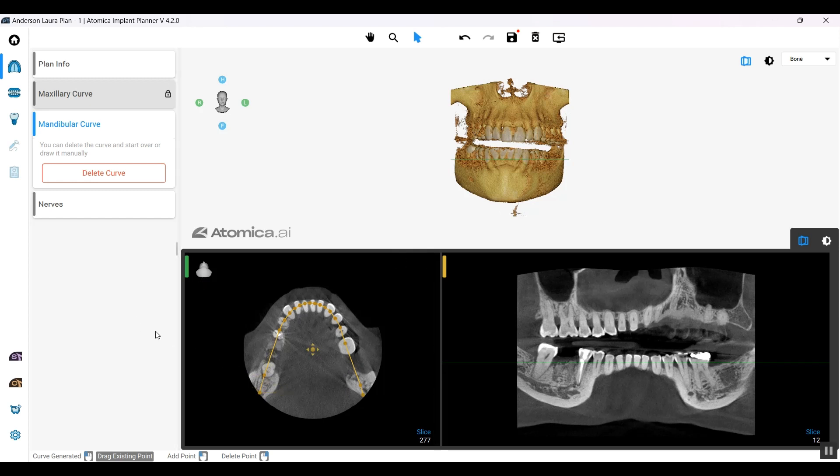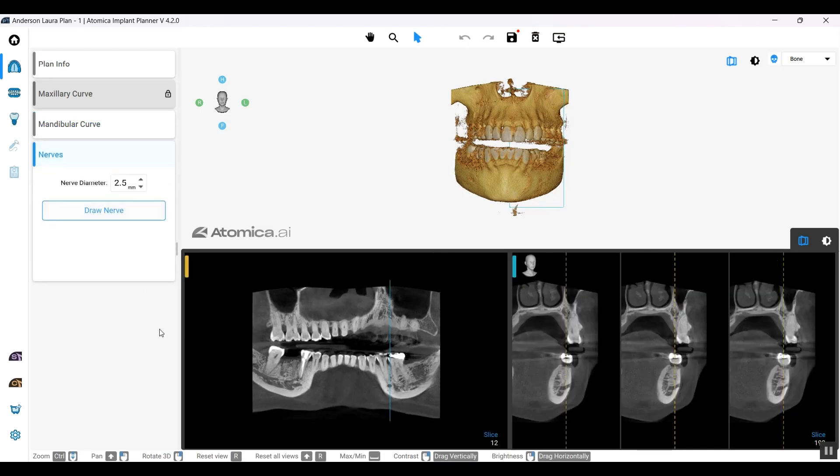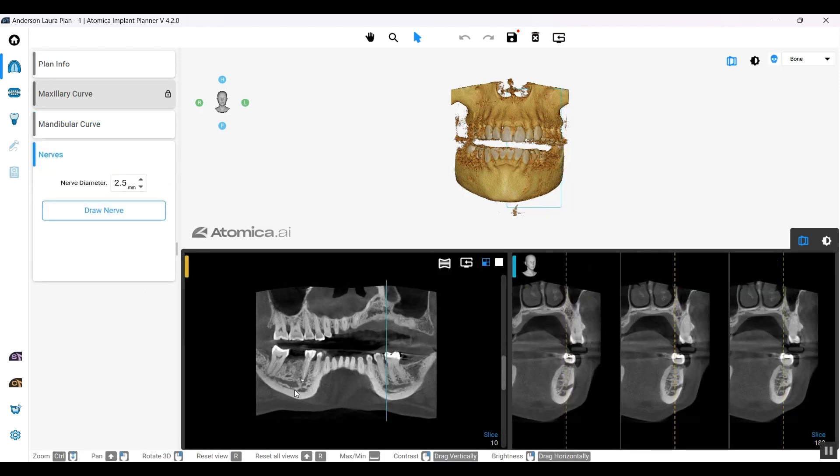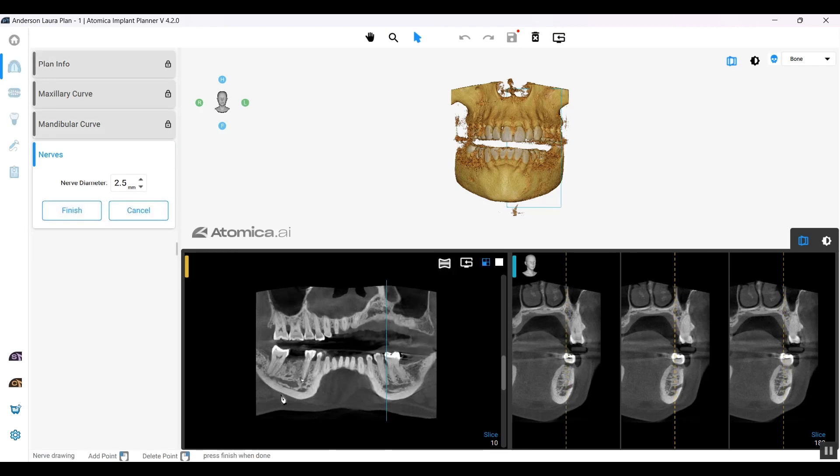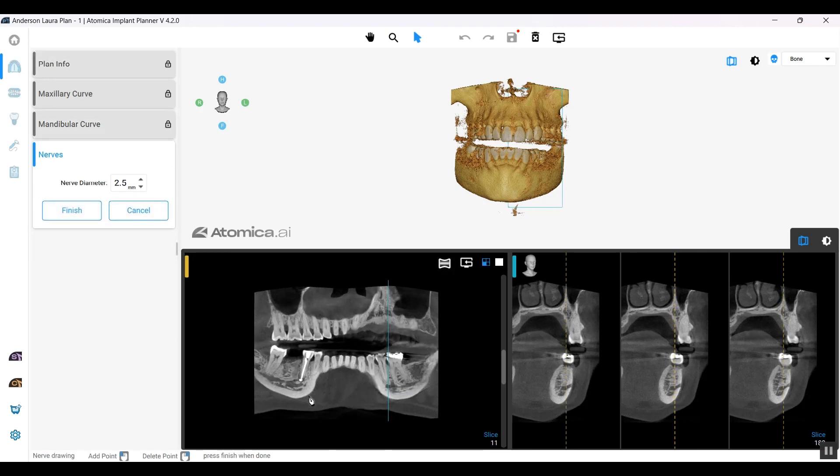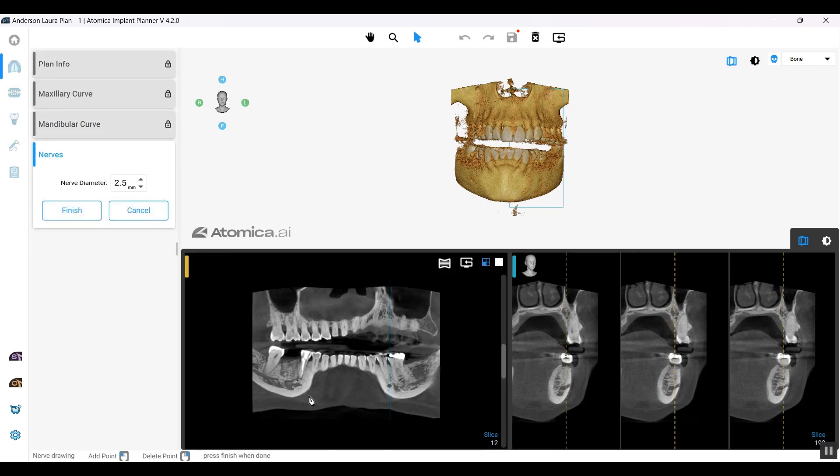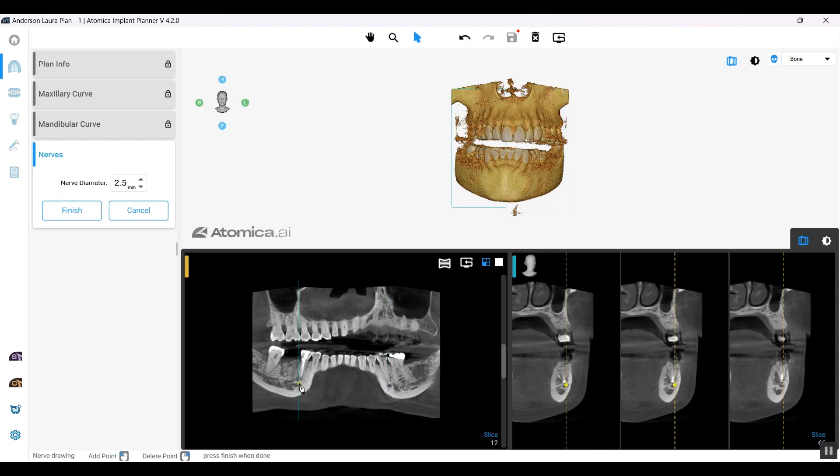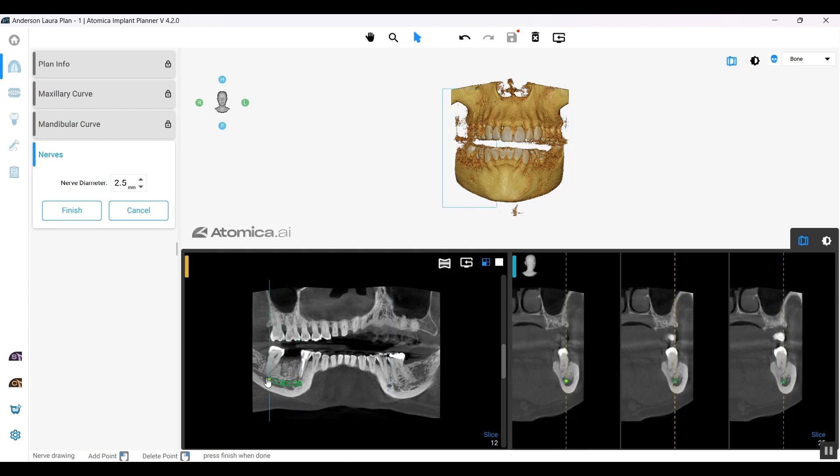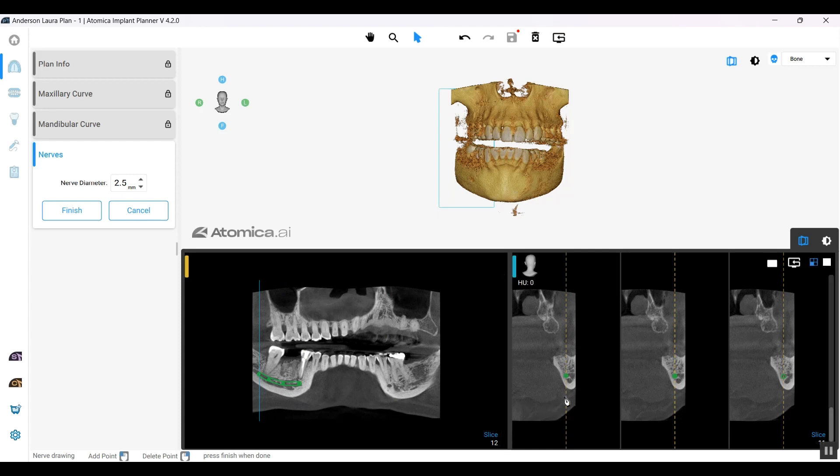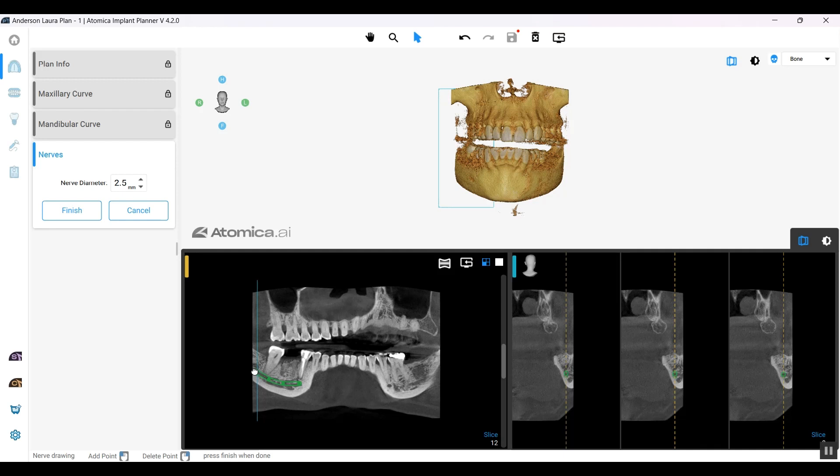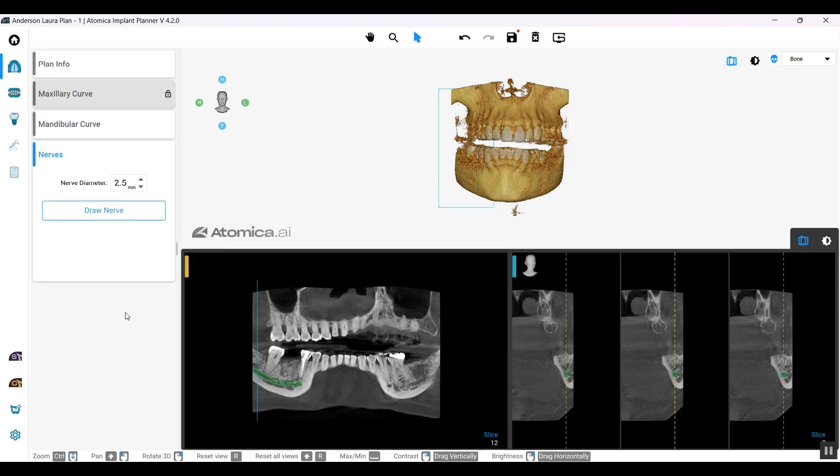Since we're planning on the lower arch, we need to trace the nerves as well. Right here I'm tracing the nerve the conventional or mandibular way, but we'll be releasing a new update soon that will be able to detect that automatically. I'll not take much time trying to trace the nerve in the correct position; this is only for the sake of demonstration.